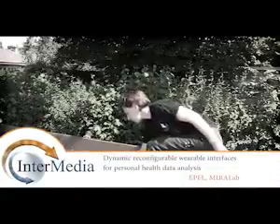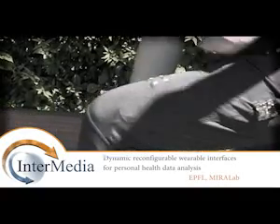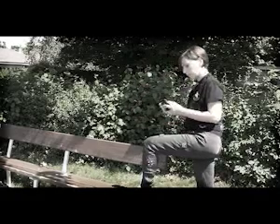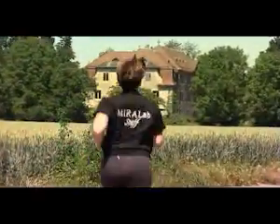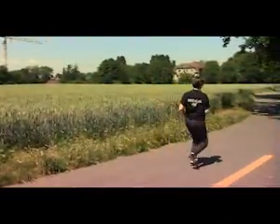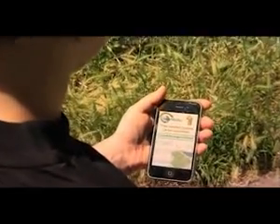The modules attached on the garment allow the monitoring and storage of her knee activity. The wearable sensors can measure the activity of her knee at runtime, process the captured data, store it in the wearable modules, and inform her about possible problems while she is running. Her smartphone is connected to the wearable modules and informs her when to stop running so she doesn't slow down the healing process of her patella.